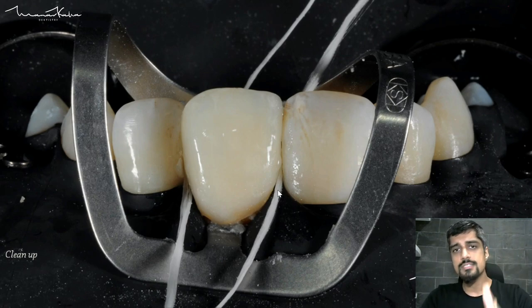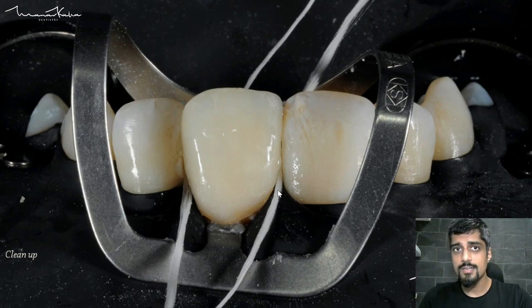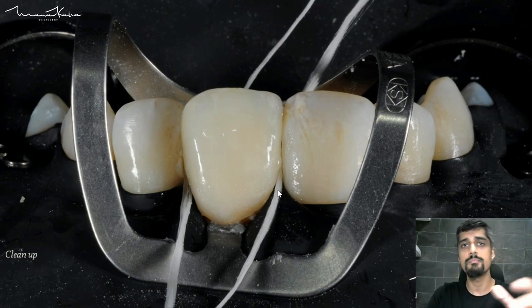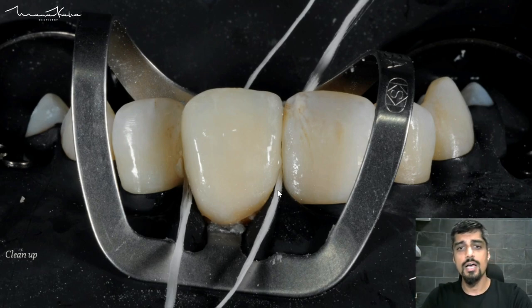This is something you need to practice, and I know many of you are going to get it wrong when you start working with resin cement. Posterior areas are even more delicate where contact points are tighter and access is more difficult. Everybody has their own ways of cleaning up — some people do a tack cure and then clean, some people clean first without tack cure. Flossing is obviously extremely important in this case.